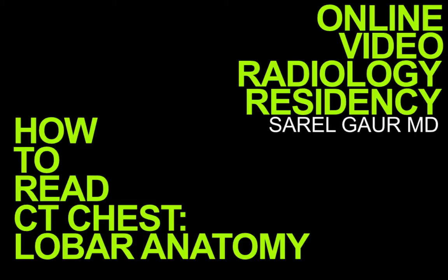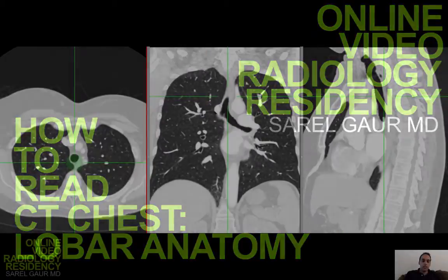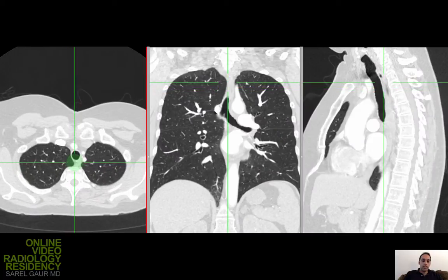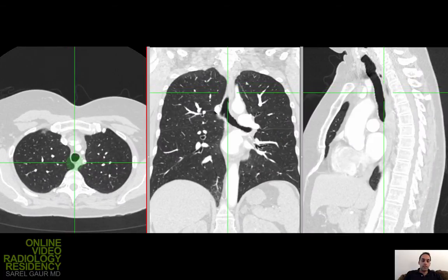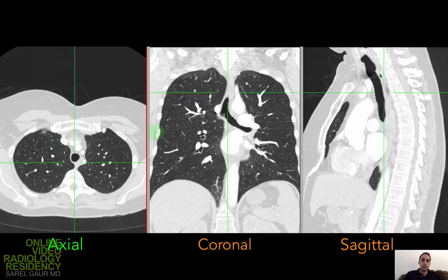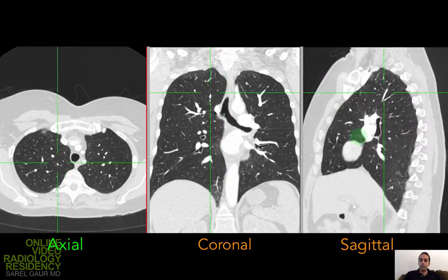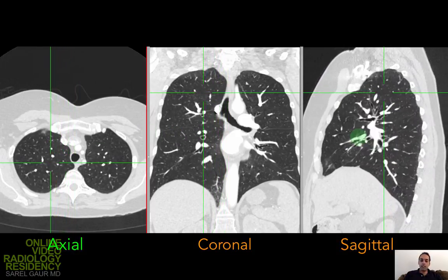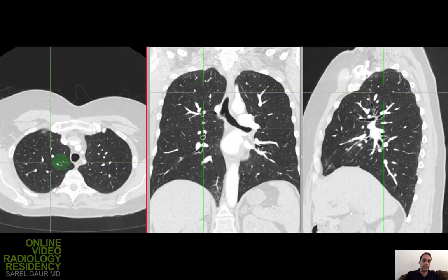Let's discuss lobar anatomy on CT. What I have in front of me is a chest CT in lung windows. I have axial images, coronal reformats, and sagittal reformats. These are about 1 millimeter in slice thickness. Let's go ahead and start discussing the different lobes of the lung.